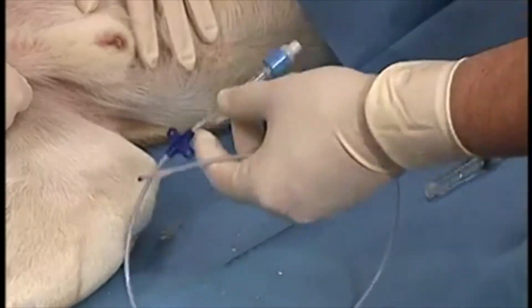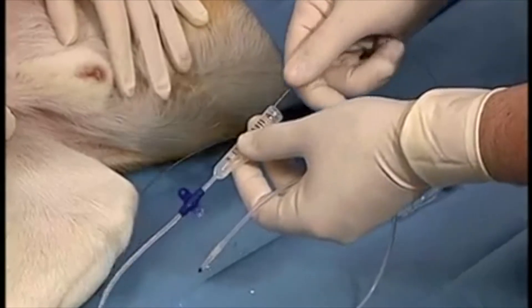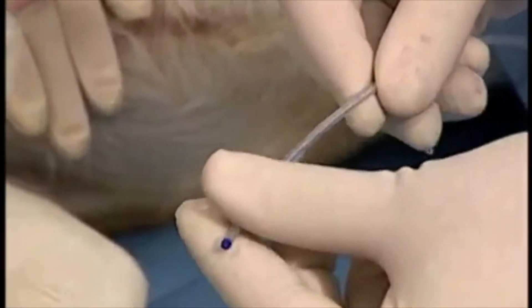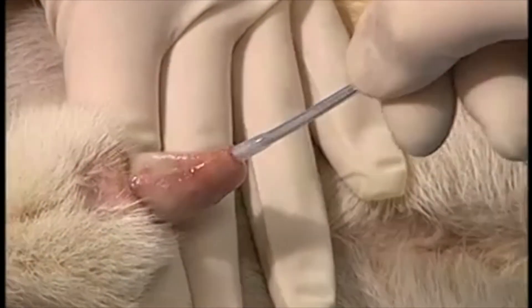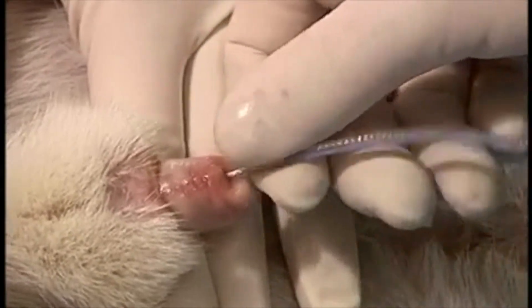The wire stylet is then inserted into the catheter to provide some rigidity during placement. The catheter must be flushed with saline to activate the inner lubricant to allow the wire stylet to be easily removed. The outer catheter is lubricated with sterile KY gel and then inserted into the urinary bladder.